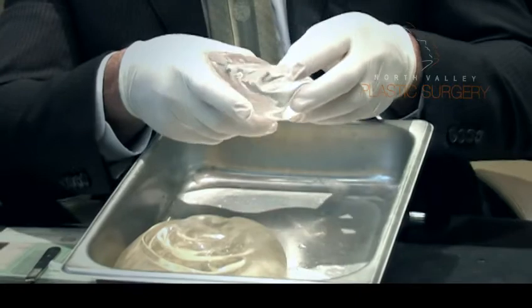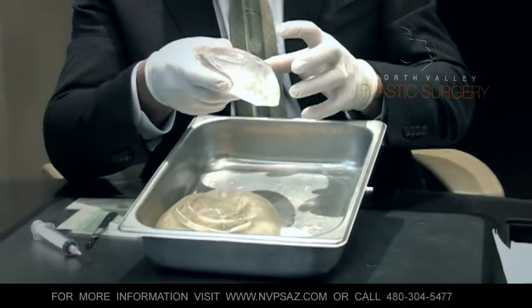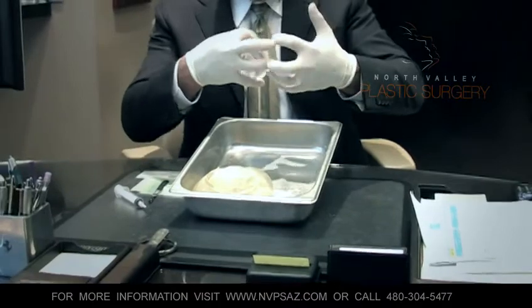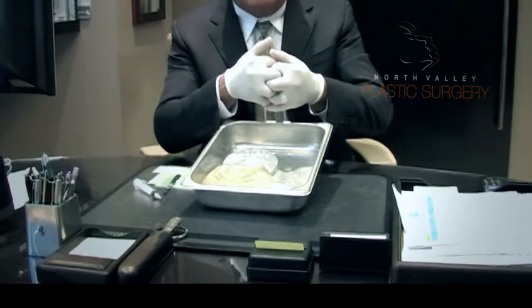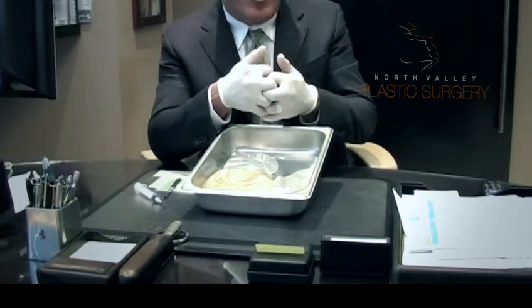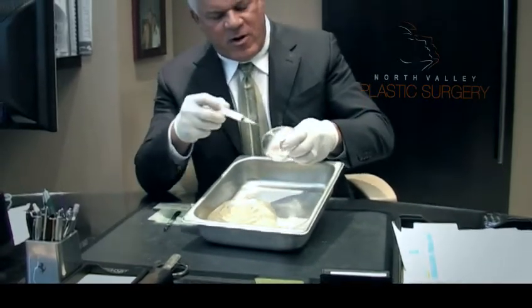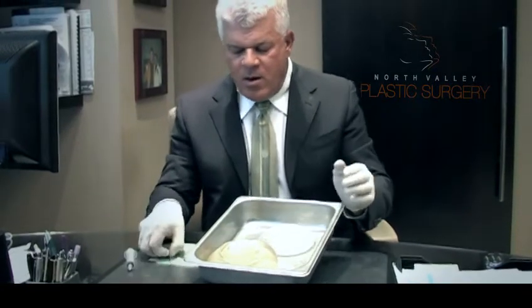This is cohesive gel. It's cohesive, and that means it tends to want to stay in one mass. It wants to stay together. It has a much higher degree of cross-linking of the silicone, and what cross-linking is just what I'm showing you with my fingers. The silicone molecules want to stick together. They don't want to fall apart. They're linked together to a much stronger and higher degree. So again, when this particular implant starts to leak, it's not so simple. It tends to stay in one place. Now, when I cut across this implant, it typically will sit still almost like a gummy bear, which is why these implants have earned the nickname of the gummy bear implants.